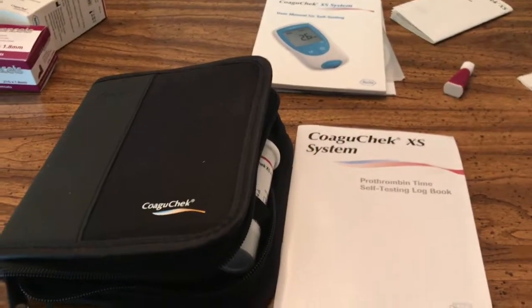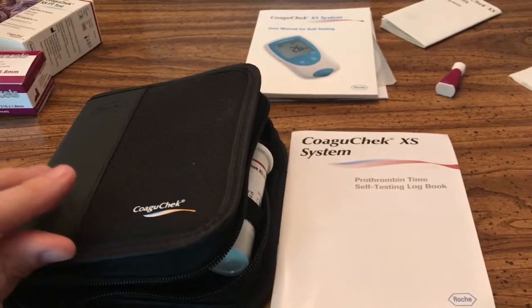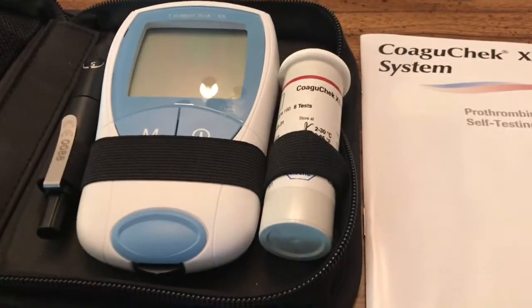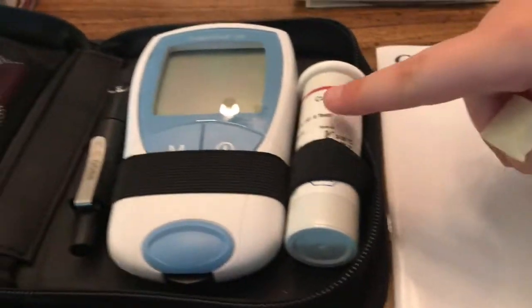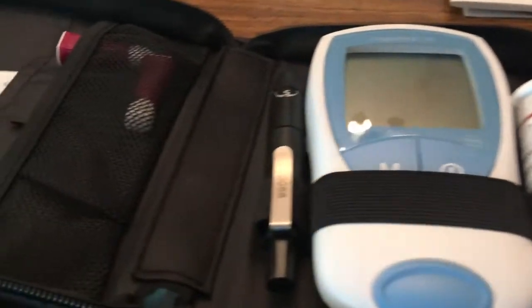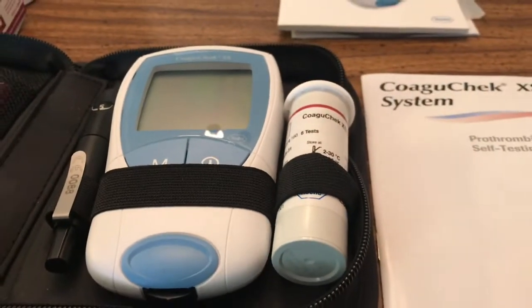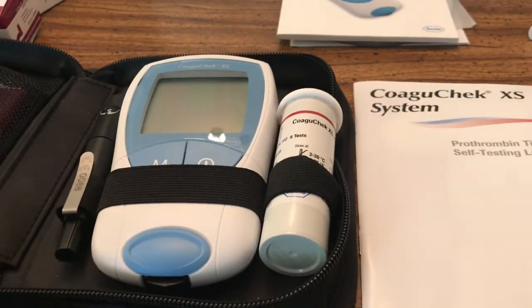So this is how the system comes — in a nice little package here. We've got the monitor in there, and I've also got my test strips as well as some of the lancelets that I use to actually prick my finger. So we're going to go ahead and get started and see how to use this system.